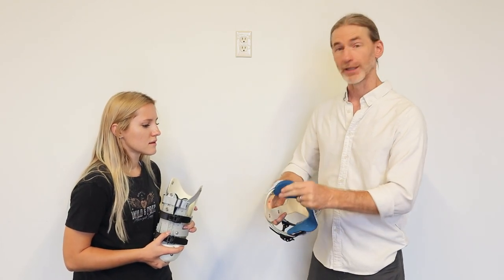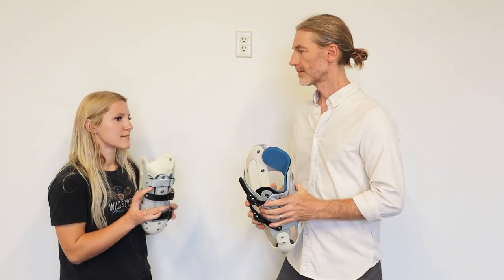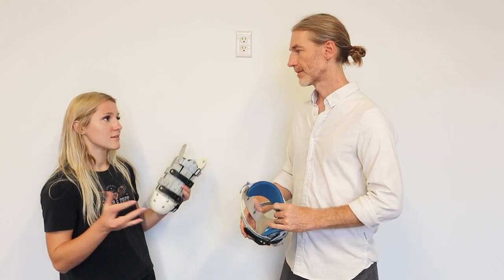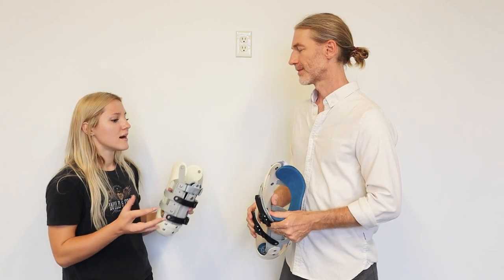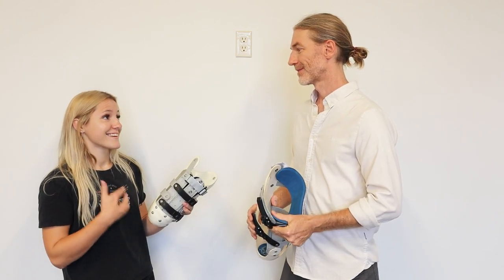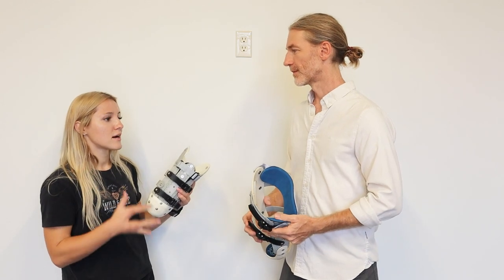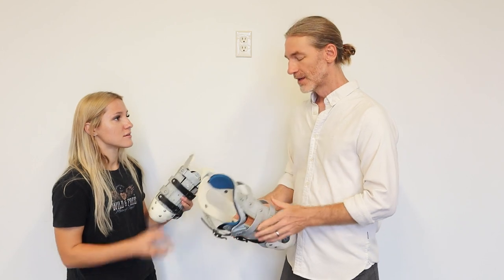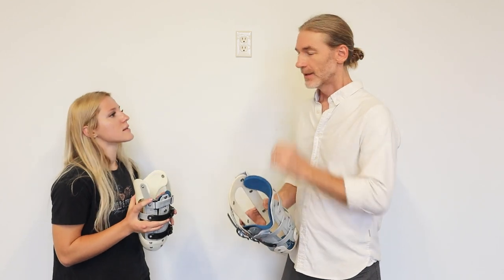For traditional sockets, the whole process of making a socket is pretty long and arduous — you could have to be recast multiple times. I got casted yesterday and already we're onto the test socket. How are you guys able to make it so much quicker than traditional? Think of this socket design similar to an erector set or a Lego set for prosthetics.